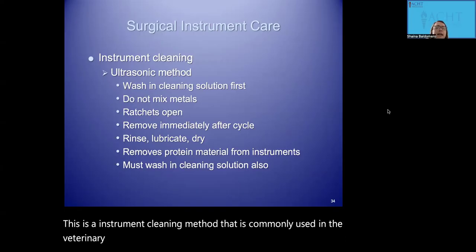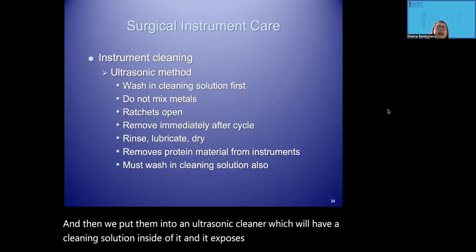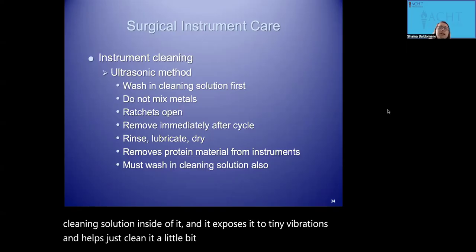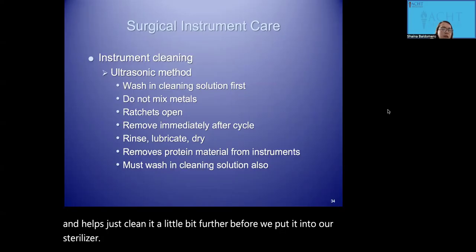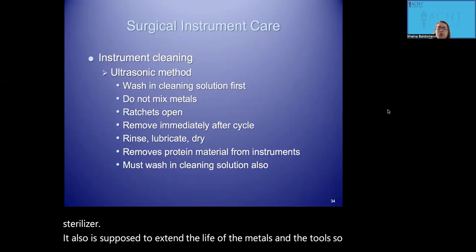And this is, again, we're going to wash them first, and then we put them into an ultrasonic cleaner, which will have a cleaning solution inside of it, and it exposes the instruments to tiny vibrations and helps clean them a little bit further before we put them into our sterilizer. It also is supposed to extend the life of the metals and the tools, so it's supposed to be really beneficial to use.